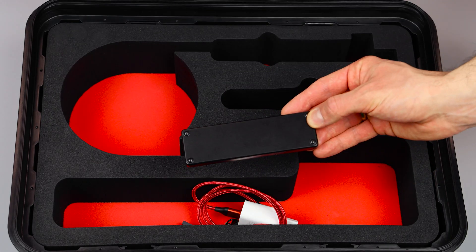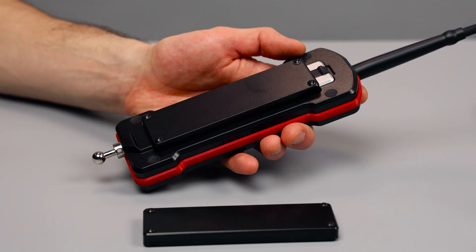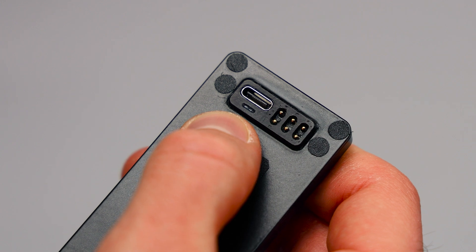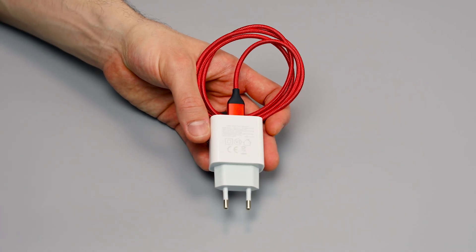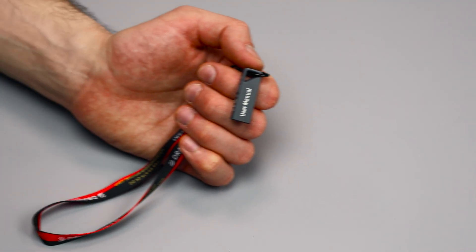Two replaceable batteries ensure you have enough power for a full day of scanning, with USB-C ports for charging in the car or at home using a quick charge charger and a USB-C cable. The supplied USB flash drive contains the user manual.